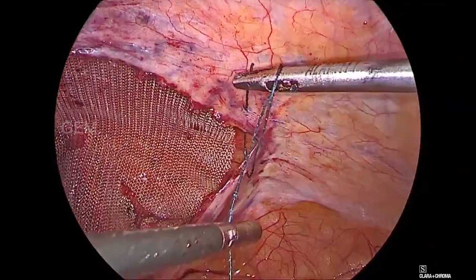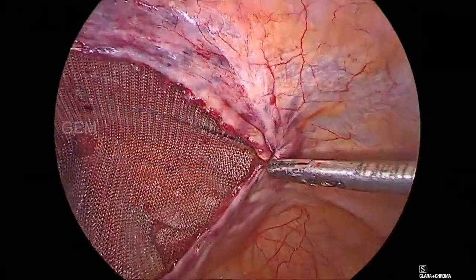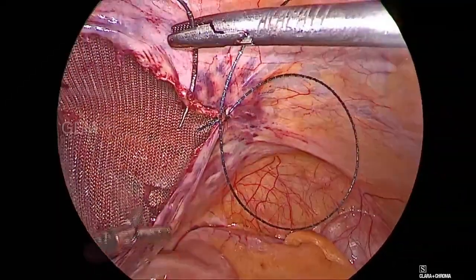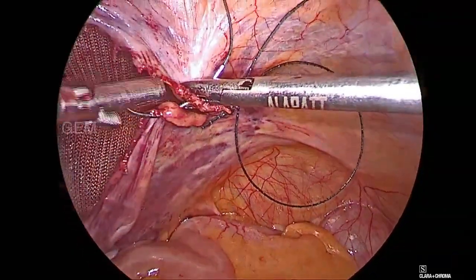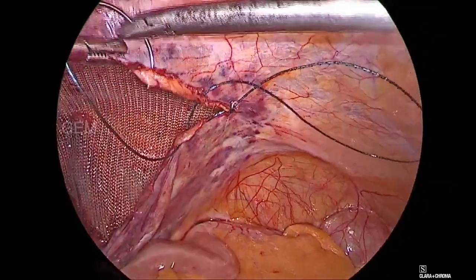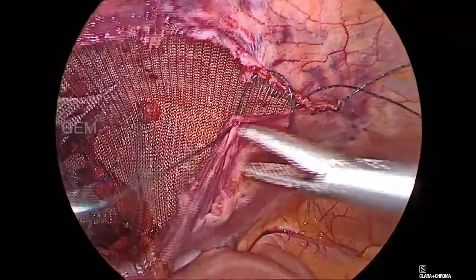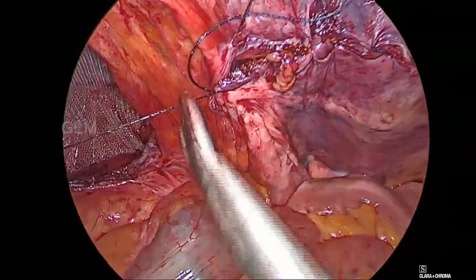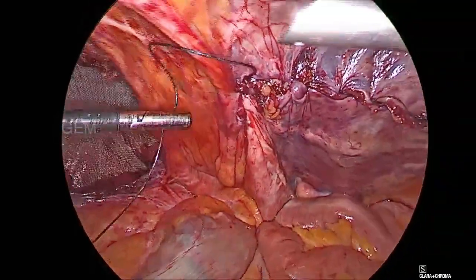Now we are closing the peritoneal flap. During closure, reduce the pneumoperitoneum so that there will be no tension on the flap while suturing. Right-sided TAPP flap closure is now complete.